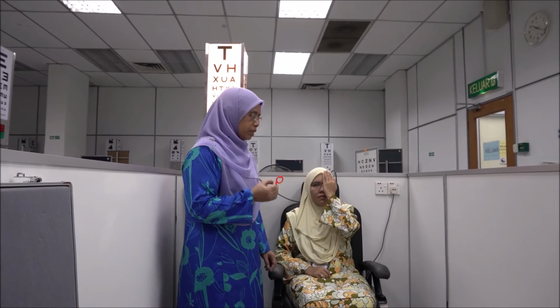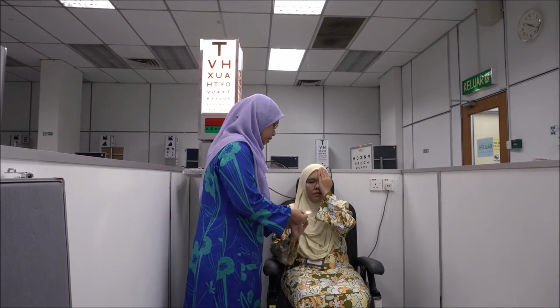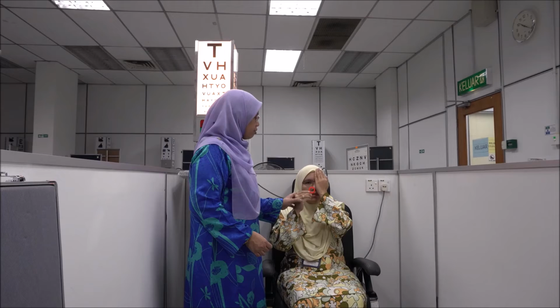Once you have recorded the visual acuity of the right eye, you ask the patient to pick a sphere lens. This is a -1 sphere lens, and put it in front of their right eye and start taking visual acuity again.